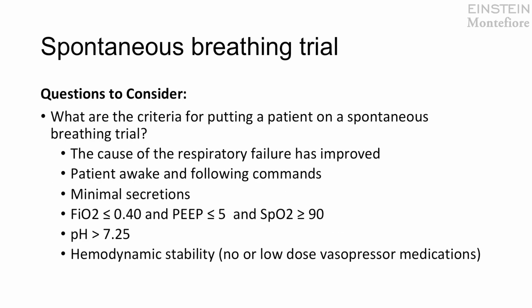So what you want to consider before putting a patient on a spontaneous breathing trial, you want to think about if they've reversed the cause of respiratory failure, if they're awake and following commands, and oftentimes we ask patients to lift their head off the bed. Do they have minimal secretions and an adequate cough to clear any secretions? Are they on minimal oxygen support? Is their pH fairly normal? And are they hemodynamically stable, meaning are they on no or very low doses of vasopressor medications?